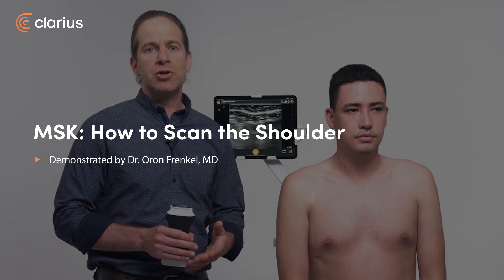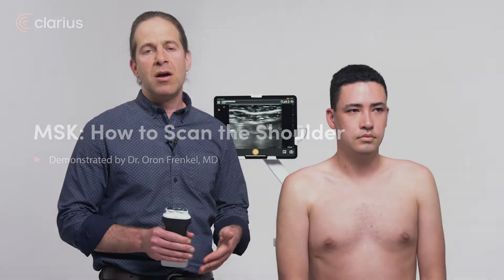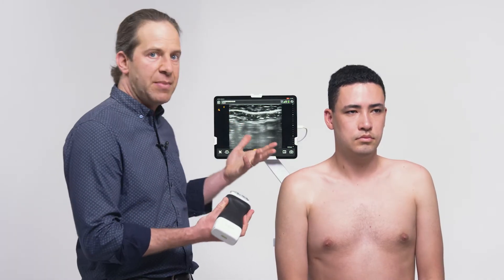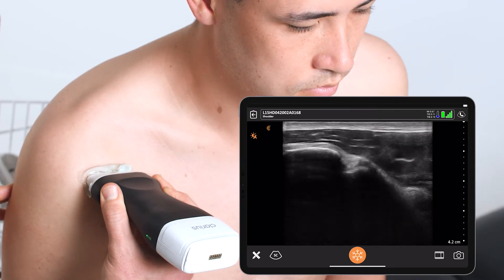In patients presenting with shoulder pain, though the shoulder is a complex joint, a focused scan can quickly identify many pathologies on my differential diagnosis. To perform a focused shoulder scan, I'm going to use a linear scanner here on a shoulder or an MSK preset, and I'm going to start the scan in transverse here at the humeral head.